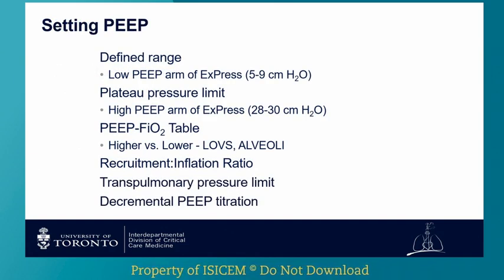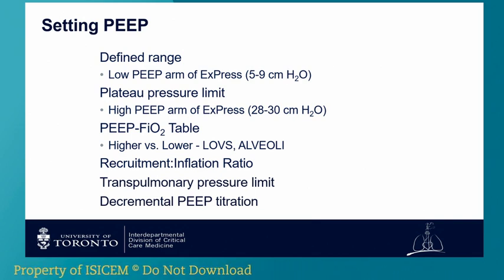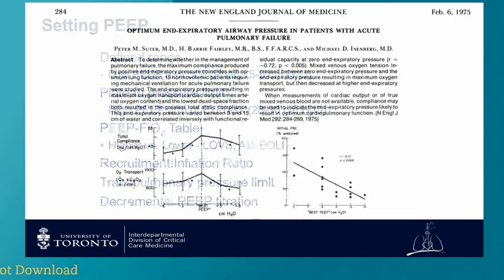Lots of ways you could set PEEP. You could just say, okay, 8, there it is. You might use a plateau pressure. You could use a PEEP FiO2 table. All sorts of physiological measurements could also come into play.